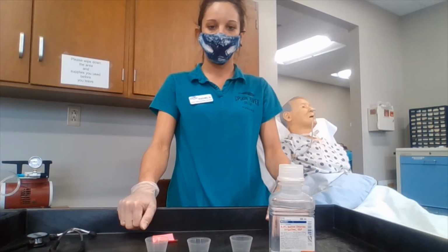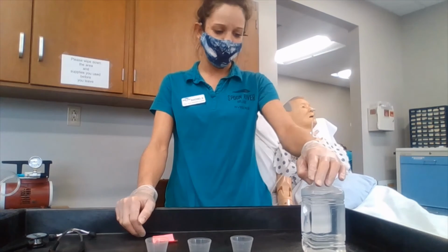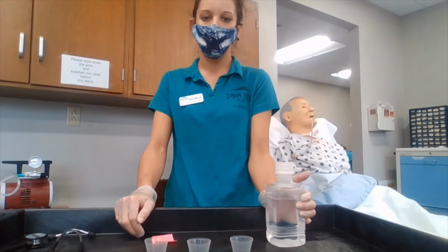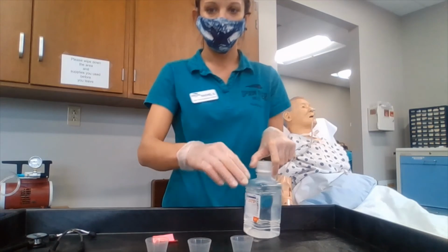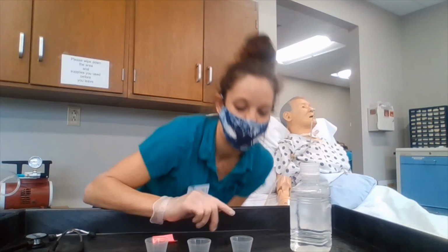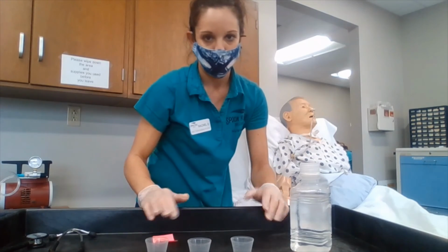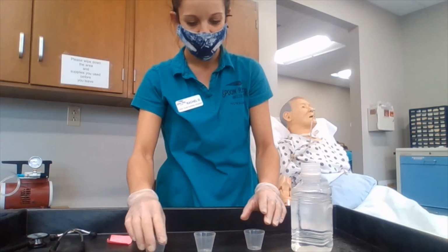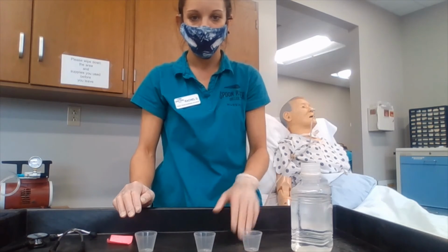With liquid medication, we are going to make sure that we are shaking the bottle, that we are pouring it with the label in our palm, that we are wiping any excess off the bottle. When we are measuring, we are going to be measuring at eye level and making sure that we have the proper amount. When we are to crush pills and put them in separately, we are going to be also adding 20 milliliters of water to each one.